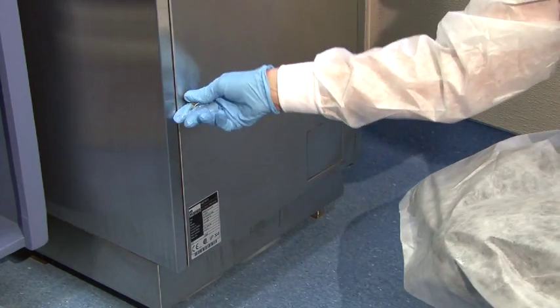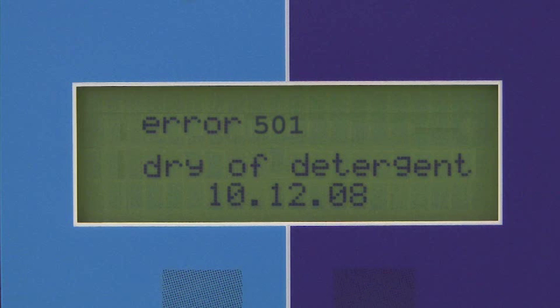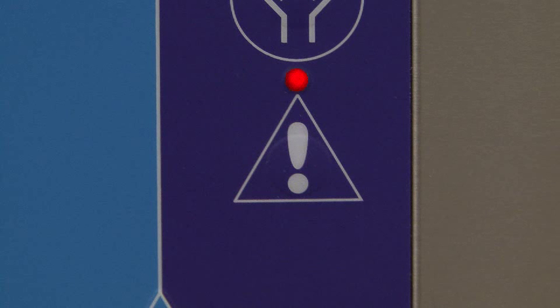If either jug is allowed to run dry, sensors will alert the Myco and it will enter a clinical lockout condition. An error message will display and the alert button will highlight red. The machine will not operate until the empty jug is replaced. If this happens, contact maintenance for assistance.